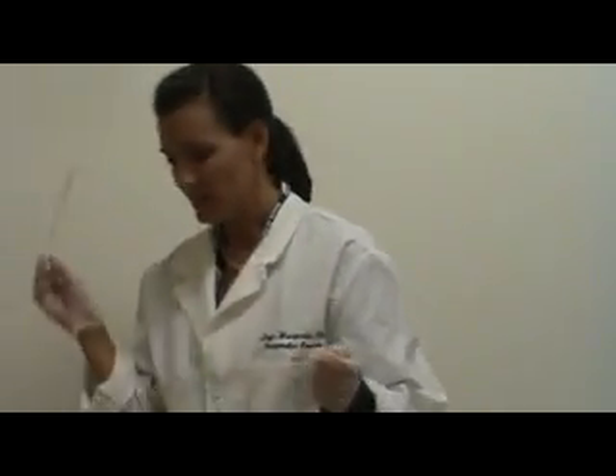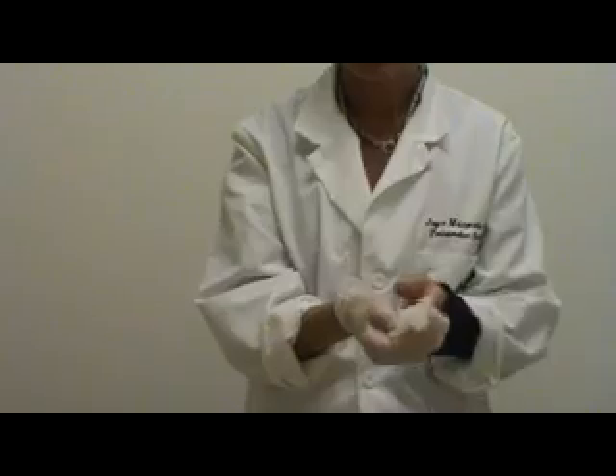I would actually throw that away, not put it near my sterile field. If this is a one-time use measuring device, I would also dispose of that. Next I'm going to remove my gloves, perform hand hygiene again watching my sterile field, and I'm going to put on my sterile gloves.